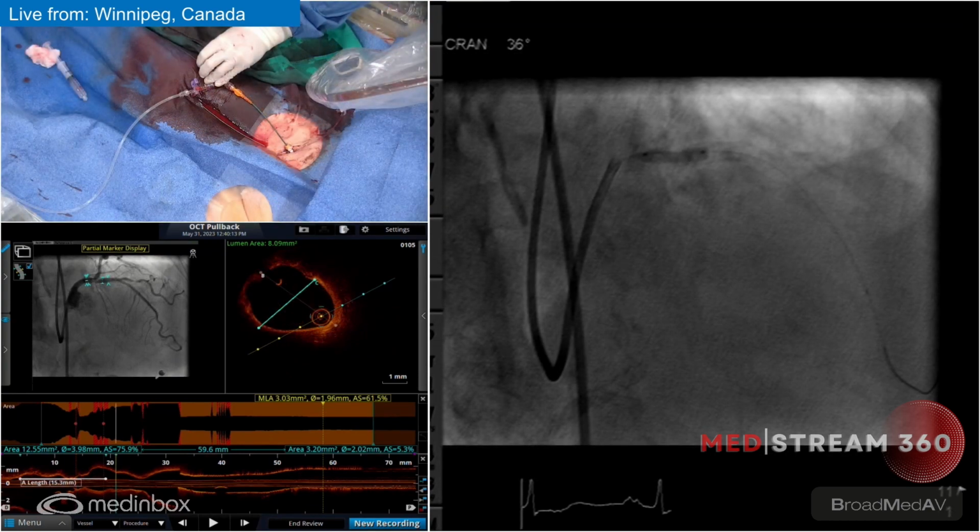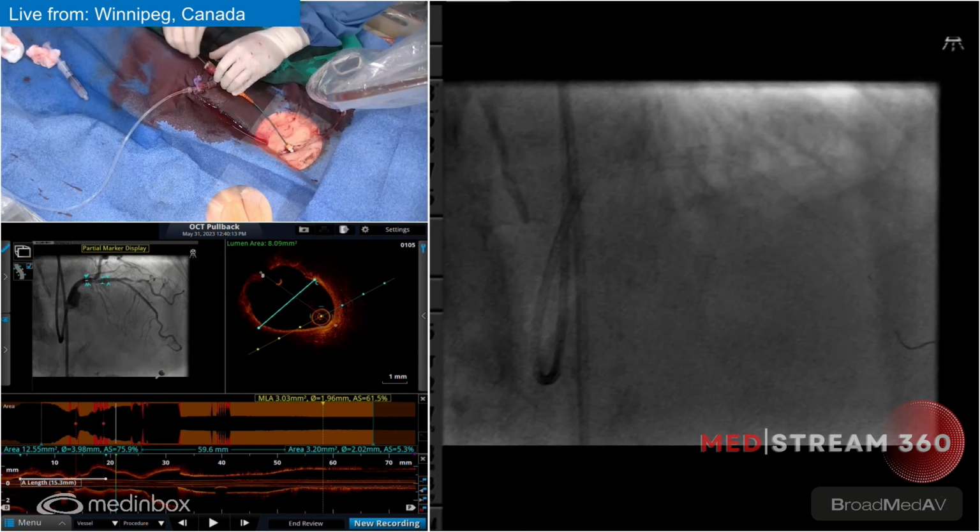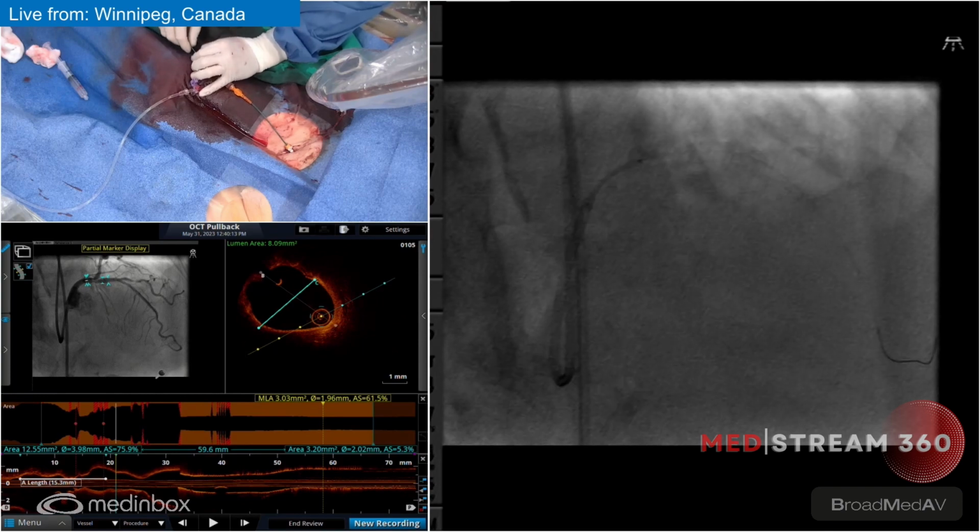As part of our practice, we always measure the MRCD for every patient, and we have it right in front of us, just in case, there's so many things going on. We always have a look at the amount of contrast we're using. So far we're doing pretty good, and there's really no limitations in terms of our MRCD. I think that's one of the things that's changed our practice over the past 4 or 5 years, getting a bit more conscious.